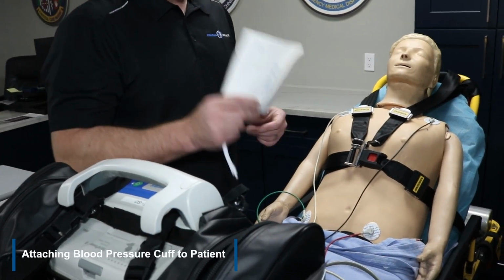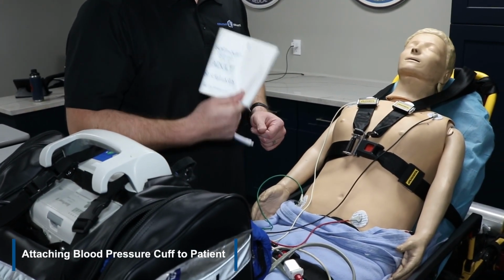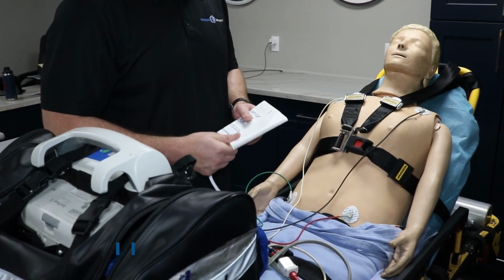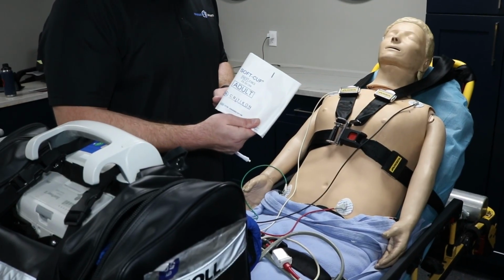Make sure you're using the correct size cuff for our patient. There are adults, small adults, child, and pediatrics or infants. We are going to be using the adult cuff today.